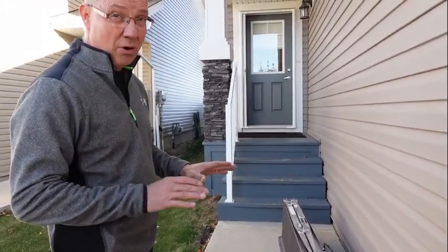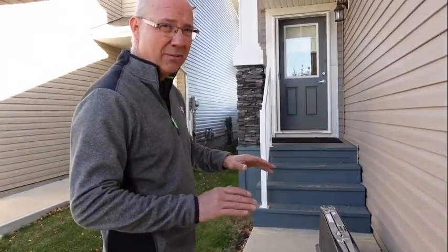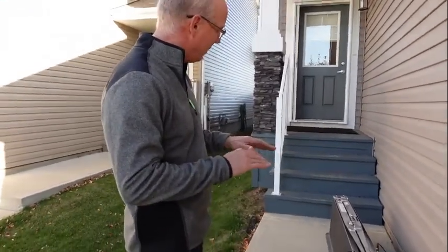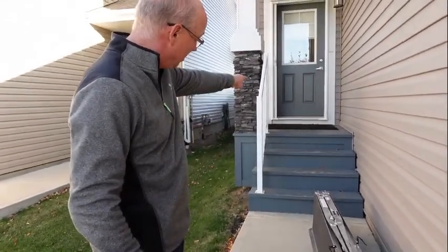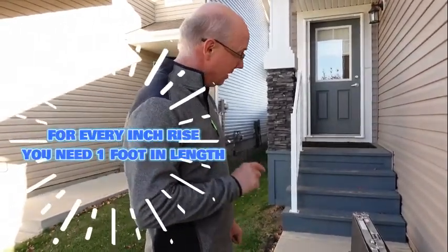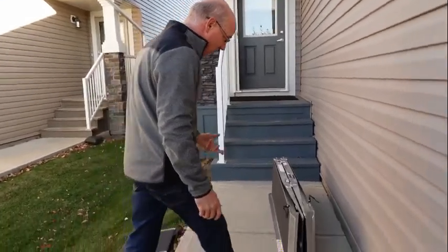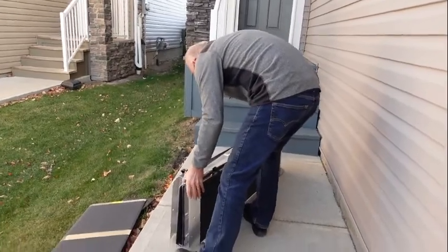These are just temporary solutions — portable ramps. They do sell permanent ramps, which we'll talk about sometime in the future. There's actually a code for that: every inch up requires a foot out. So if you measure from the concrete up to the door sill, and that's 30 inches, you'd need 30 feet out. An inch up is a foot out. In this particular case, we're just trying to get people home after being discharged — let's find a solution.